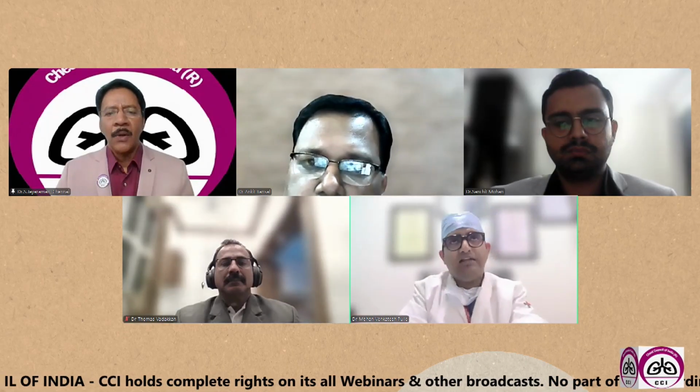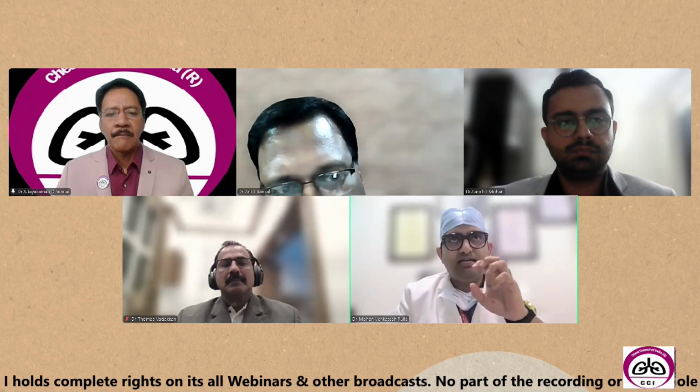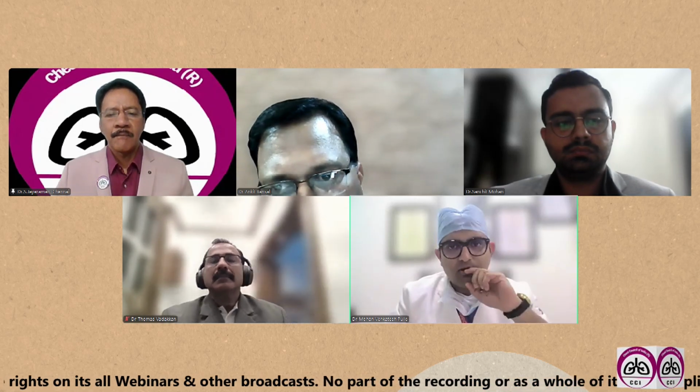And the third important thing is when there is a hilar tumor, a good sized, highly avid tumor, and the size of the lymph nodes is smaller.